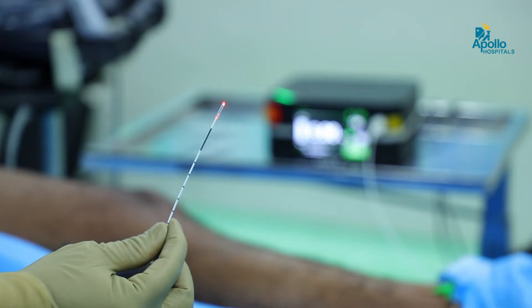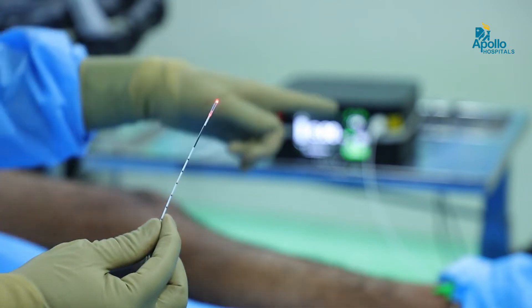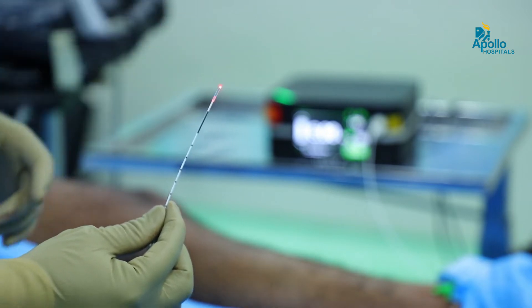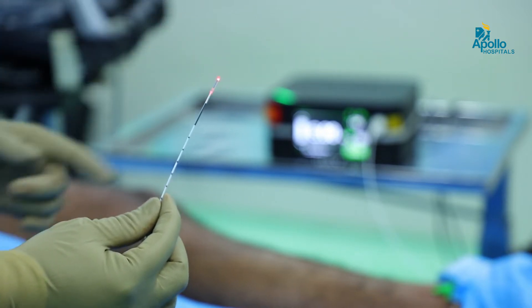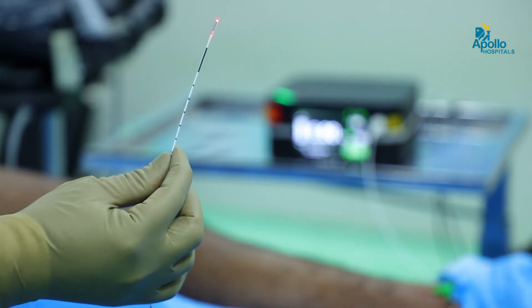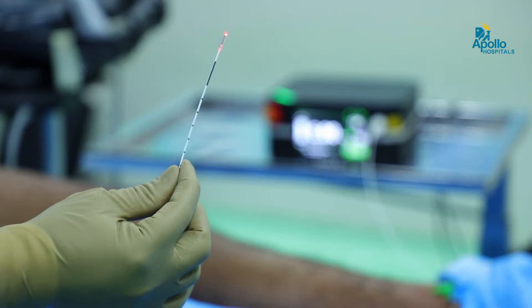This is the new 1940 laser fiber which is connected to the laser machine and we have kept a continuous 6-watt setting running for varicose vein treatment. We have kept it in continuous mode. This fiber has a light at the tip so we can see exactly where the fiber is inside the vein.